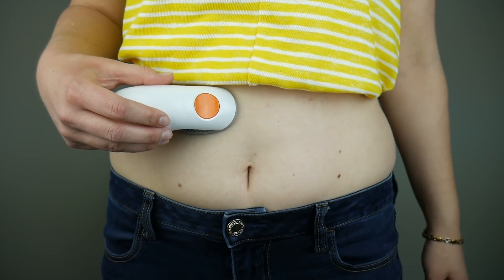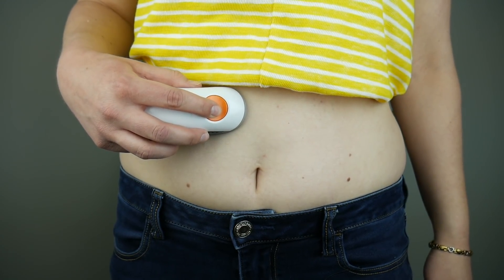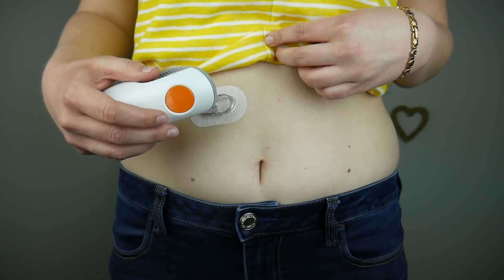So now it's all stuck down and I'm ready to insert it. The way you insert it is just an easy one-button push — one, two, three. There we go! Boom, it's in!